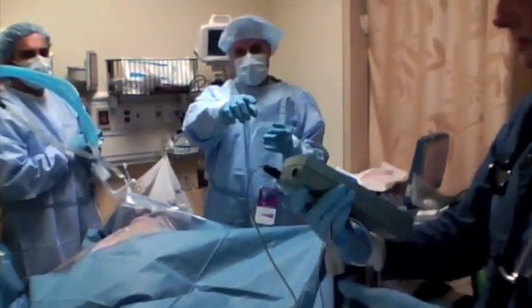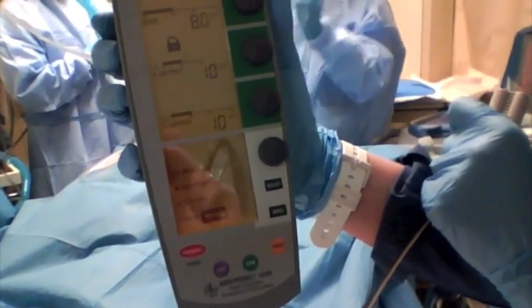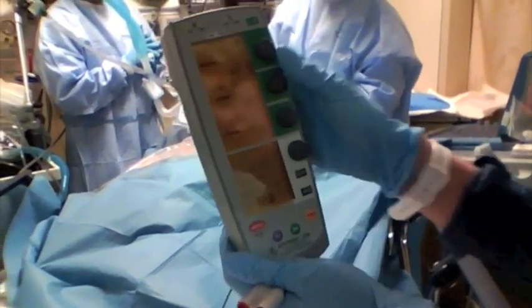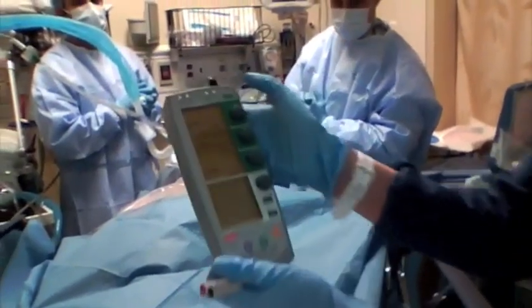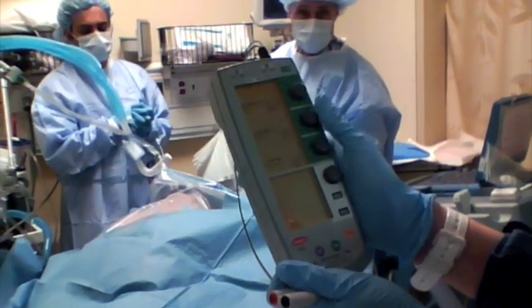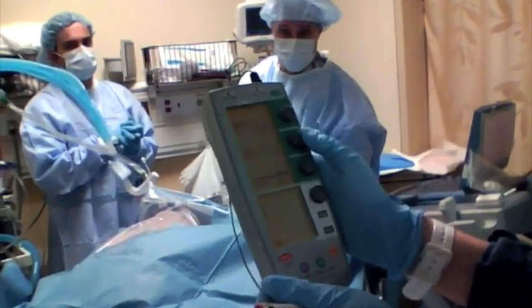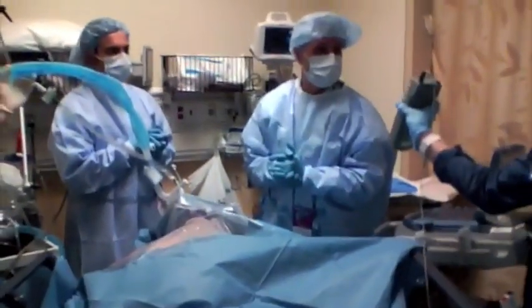Turn the box around. You're going to put the ventricular rate up to 80, which is fine for him because his heart rate's 40, so we'll be able to see when we get capture. Take the milliamps and turn that all the way up — the output goes all the way up as well. If the thing locks, you have to unlock it — push the lock button up top. Set the ventricular output as high as it'll go, and set the atrial output to zero because we're not going to use that one.